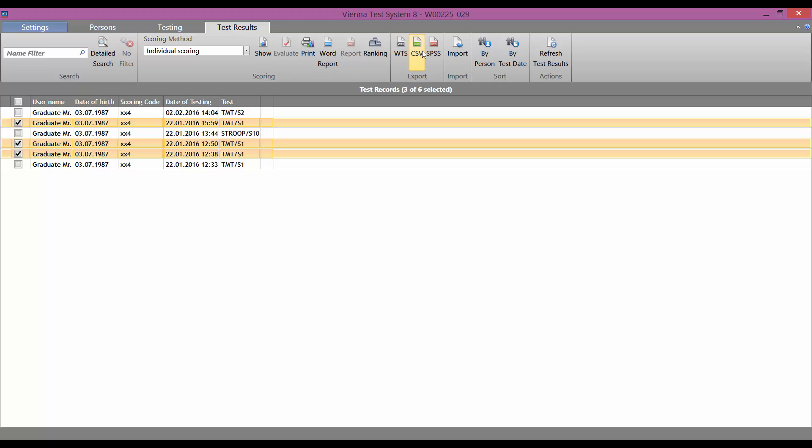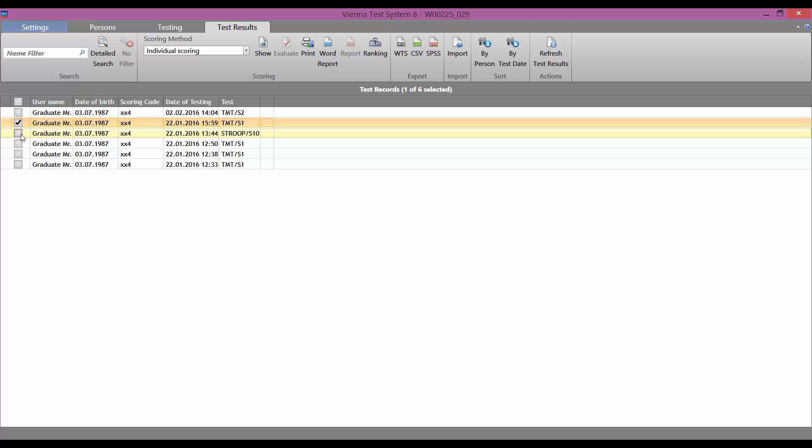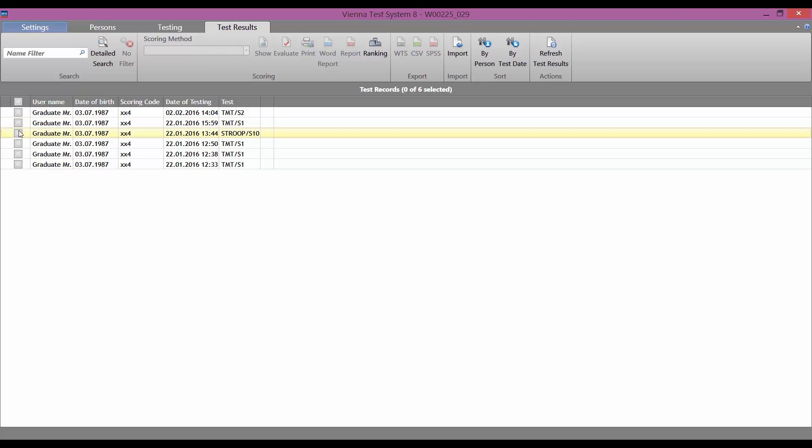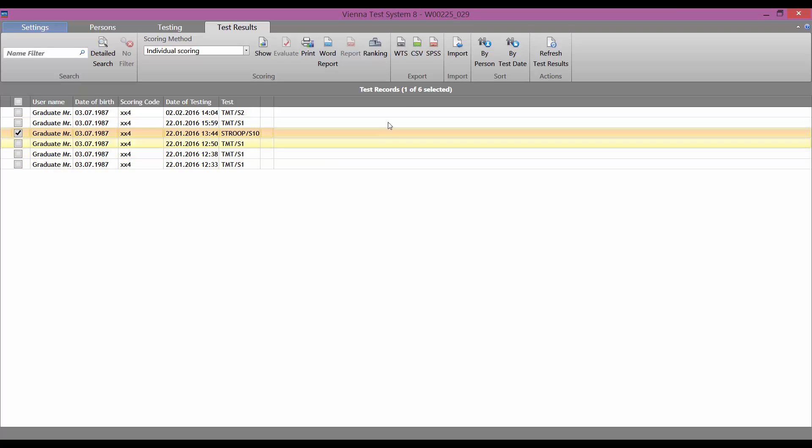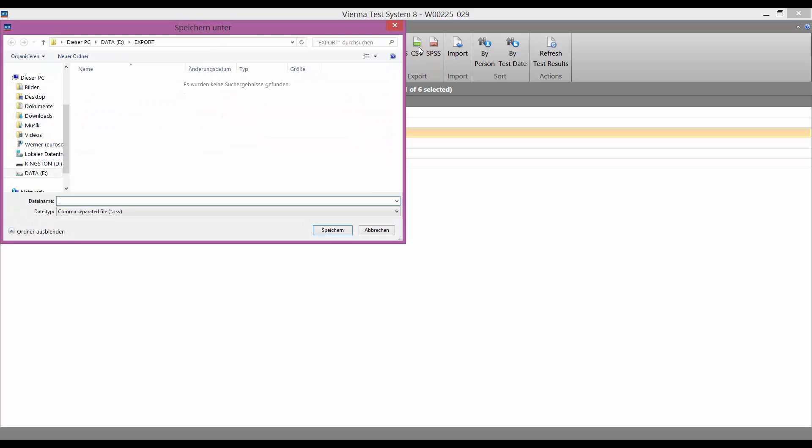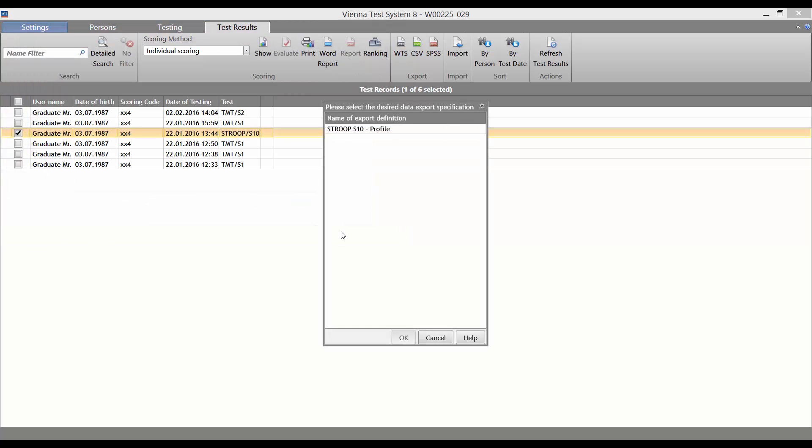We see that the green and white CSV button in the export menu is now active. Next, we select the required test result and then click on the CSV button and enter a name for the export file. Now we need to select the required export profile.